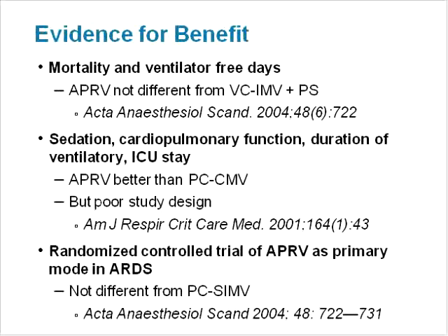One small randomized controlled trial of APRV as the primary mode of ventilation in ARDS showed no difference in clinically relevant outcomes. Now, I don't mean to suggest that these are the only studies out there. On the contrary, there are many, and there are more coming all the time because APRV and BiLevel modes are gaining popularity. But we still have no conclusive evidence that this mode is superior in terms of morbidity and mortality than any other mode, just as we have no evidence that any mode is better than any other mode, and we may never have that.